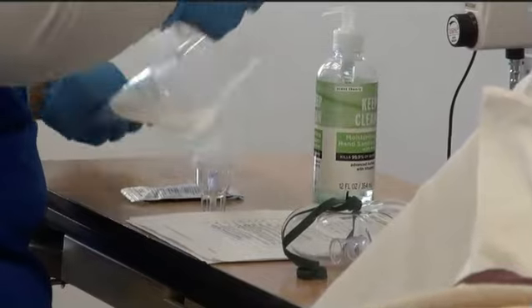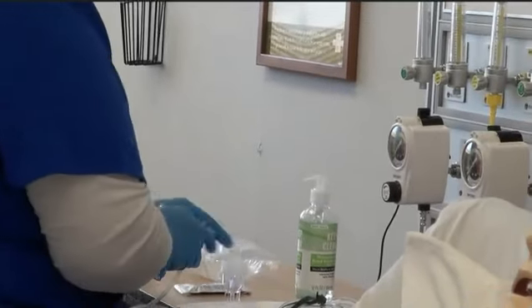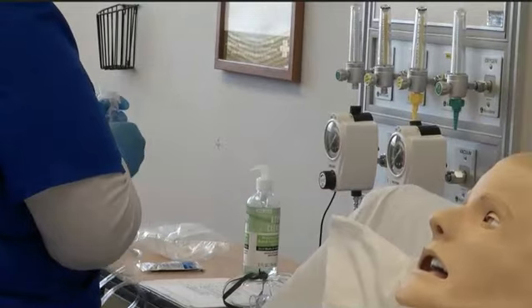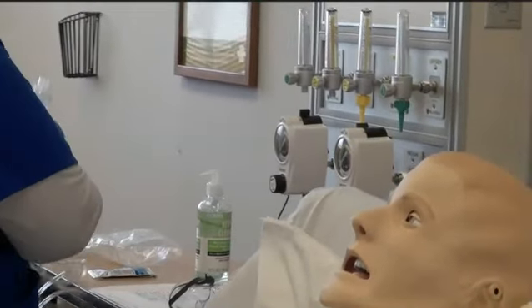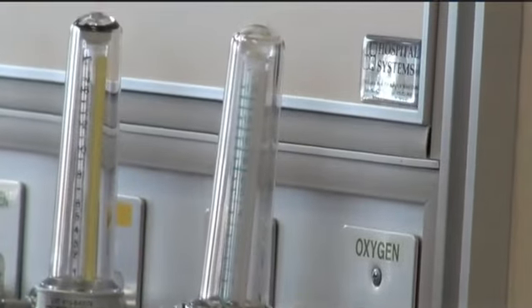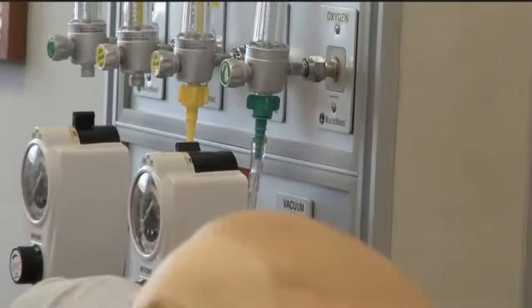And last, she is taking out the oxygen tubing. She will untangle the oxygen tubing and connect it to the bottom of the nebulizer. Then she will take the other end of the oxygen tubing and connect it to the flowmeter. Remember, green means oxygen and yellow means air.